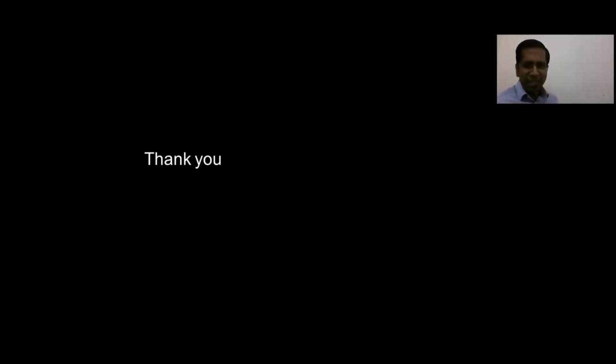So moving on to the next question: how to measure LA volume index? Would you like to answer this, or will we be covering the hemodynamics in your next presentation? Sure, I can do it again at that time.